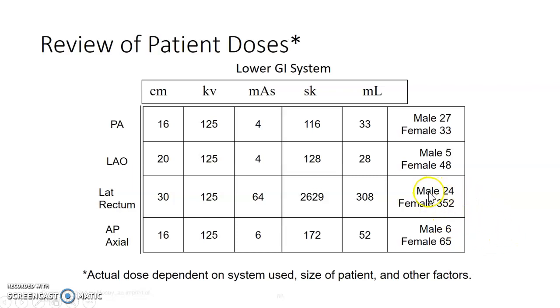Why do you think these are? Right? The male anatomy can be shielded. It's outside the area of interest. It can be shielded. Females cannot. So a BE is a much higher dose for females than males. If you think you can shield, try, but sometimes it's just a little bit too messy. So your collimation is key, and centering accurate, technical factors ideally accurate. Just be aware, females are much more susceptible to radiation in the areas for this BE exam. And that rounds that.